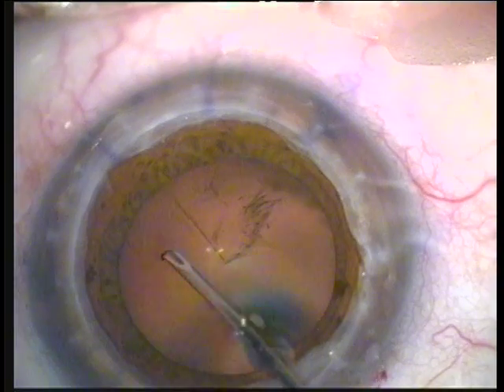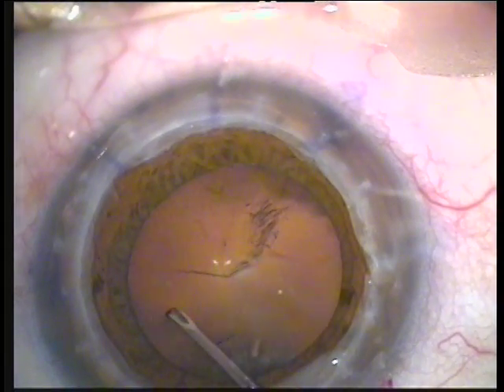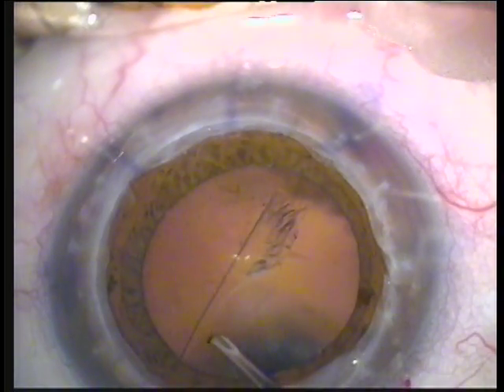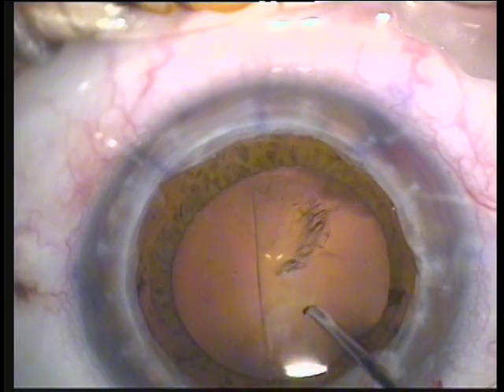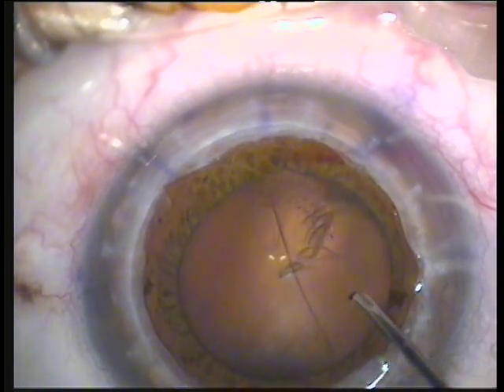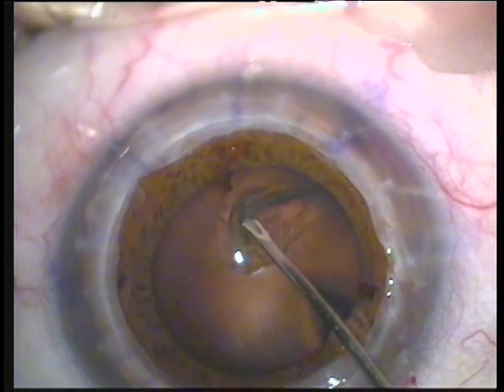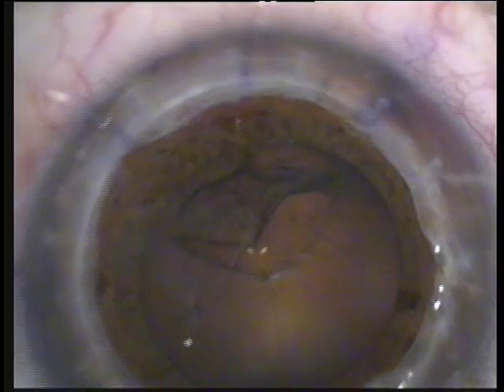It's quite a challenging technique as there's no pressure from the viscoelastic onto the anterior capsule. Special care is being taken here to manipulate the capsule and not have the continuous capsulorrhexis run to the periphery and compromise the support for the further cataract extraction. You can see things go well here — the capsulorrhexis is almost completed. It's a large capsulorrhexis of about 6.5 millimeters in diameter, and the continuous capsulorrhexis is performed perfectly.